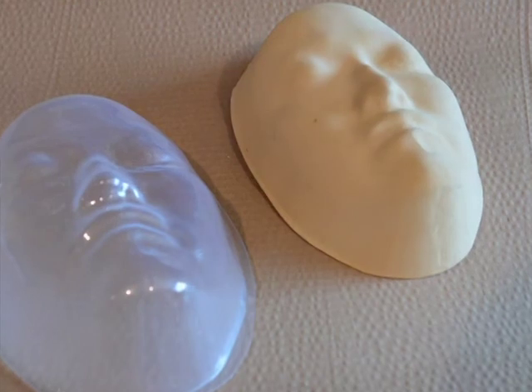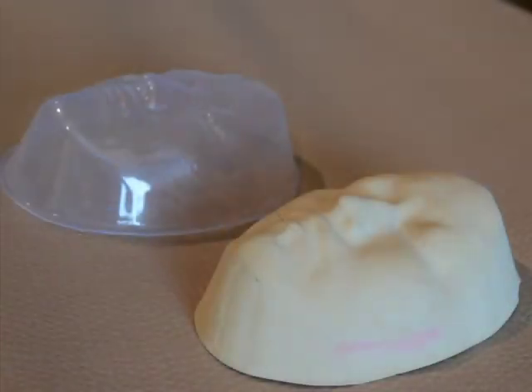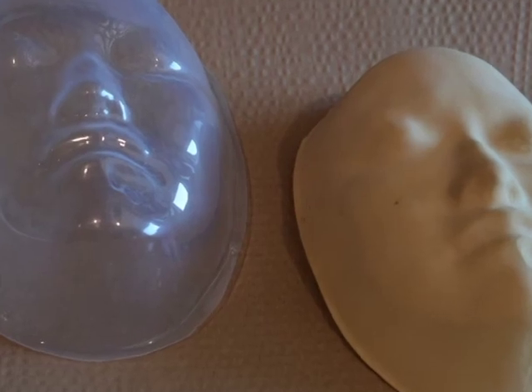Burn patients wear masks to minimize the scarring and the effects of the scarring on the patient's face.